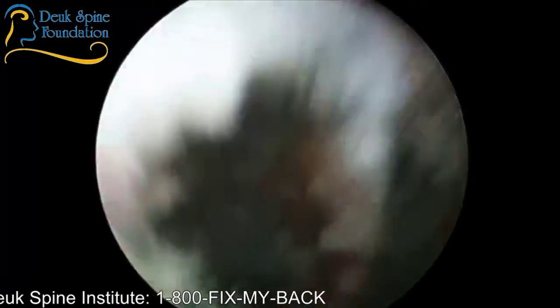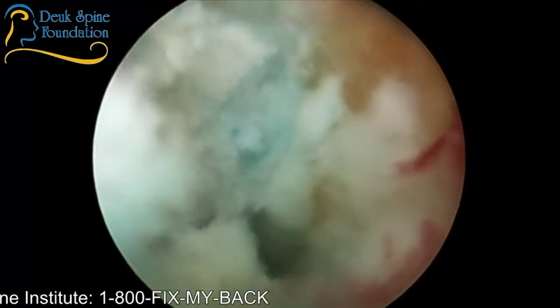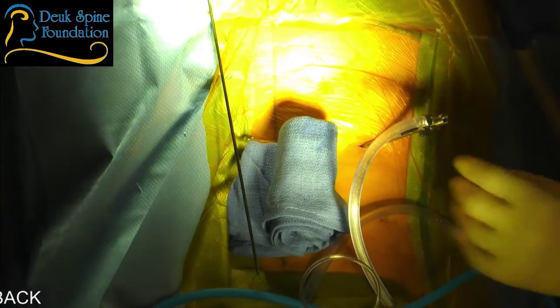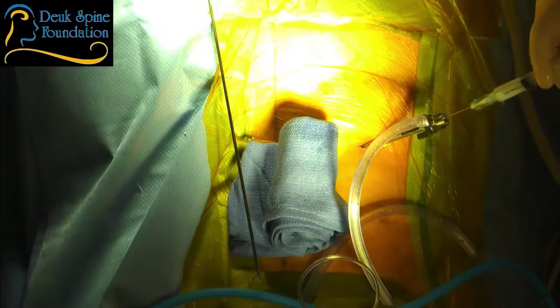All right, we're done. That was our last disc, the third disc. Sucking the water out. Hey, Patel, is it work? Yes. Okay. He came before to follow. Cool. Yeah, we're ready. We're done.